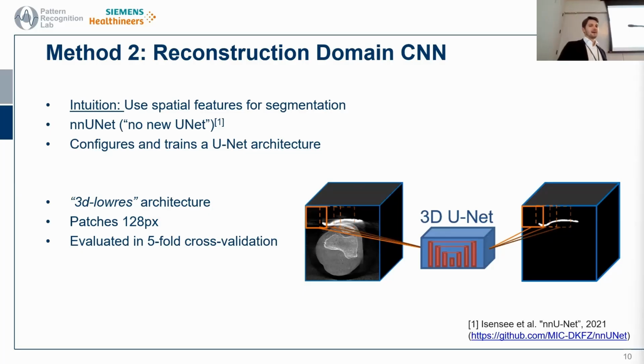So the very distinguishing fact or difference between metal segmentation and any other kind of segmentation like organ segmentation is we have a strong prior, and that is the value. So just based on the value, we should be able to obtain a pretty okay prior segmentation kind of. So I totally agree with you that a less complex model in the reconstruction domain should be totally possible. Doesn't have to be a full blown one.